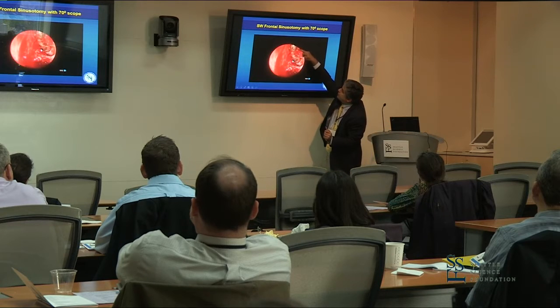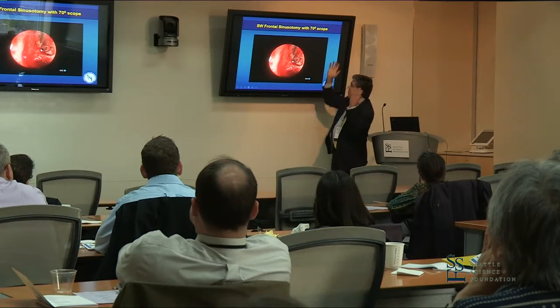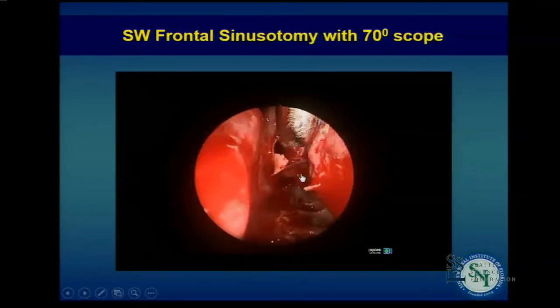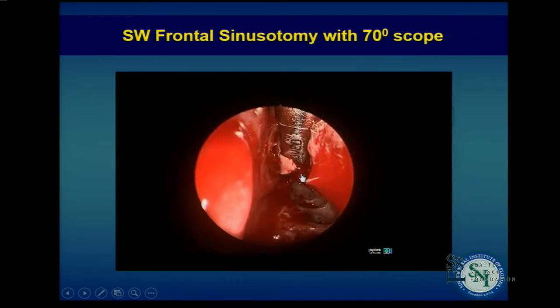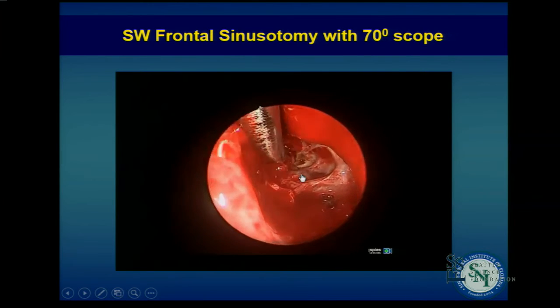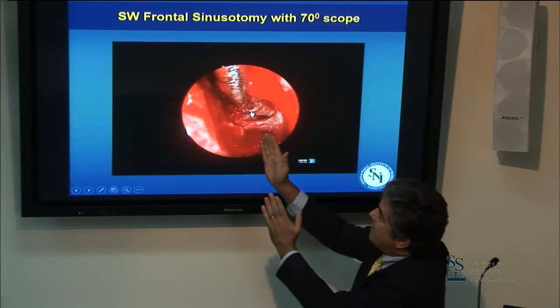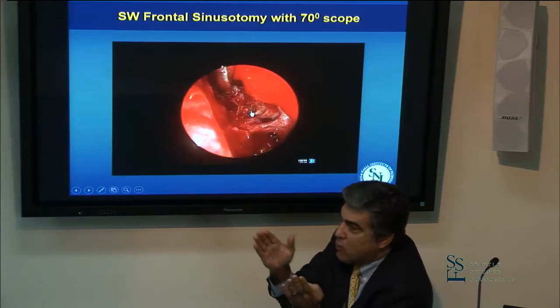I have no commercial relationship with anybody — I noticed one of the companies has their name on screen; they're so smart, they know we're going to teach and show. The work goes on, and you can see I'm using suction, and my motions are parallel and toward the orbit — not up and into the cribriform digging. Those are things you need to do to safely open the frontal recess area in this dangerous location.